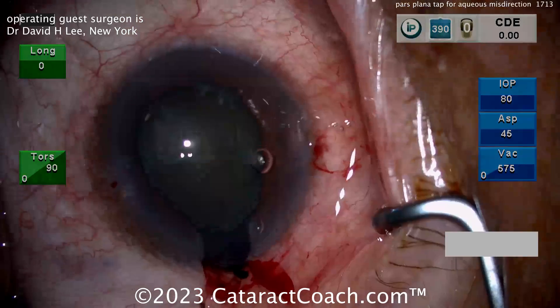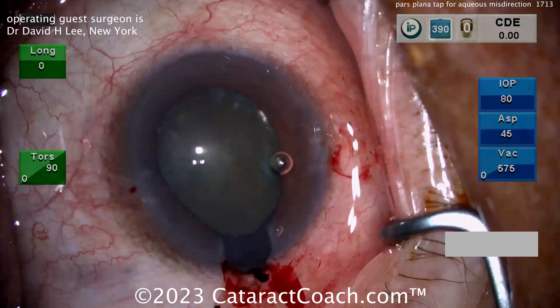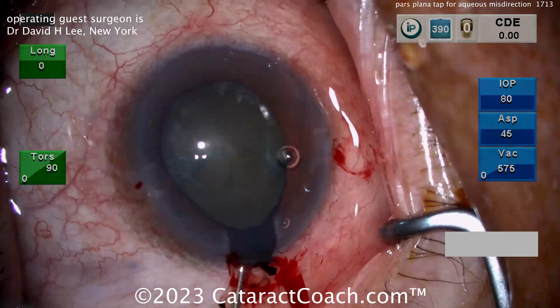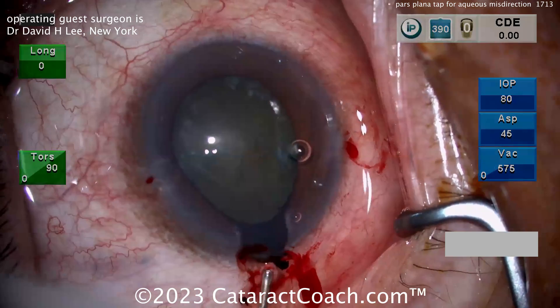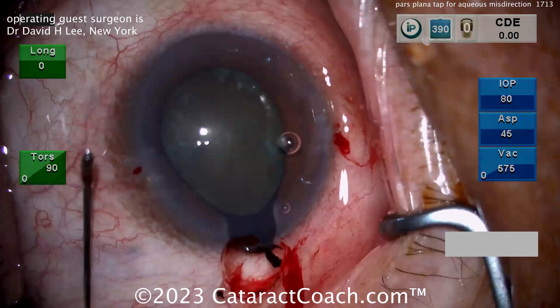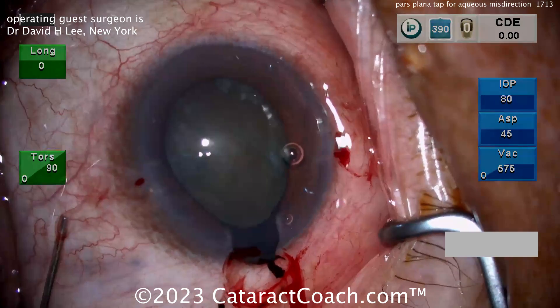Think about it — it is a pressure gradient; you've got to resolve that pressure gradient. Again, pushing the iris back in the eye is a good attempt, but what's really going to solve this is you've got to release that pressure gradient first, and then the iris will want to go back inside the eye on its own.